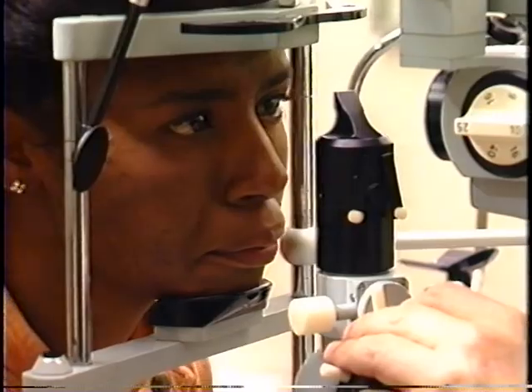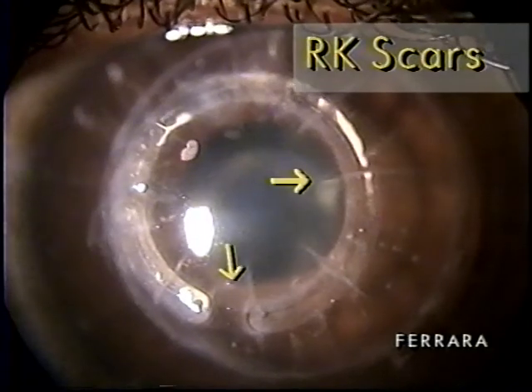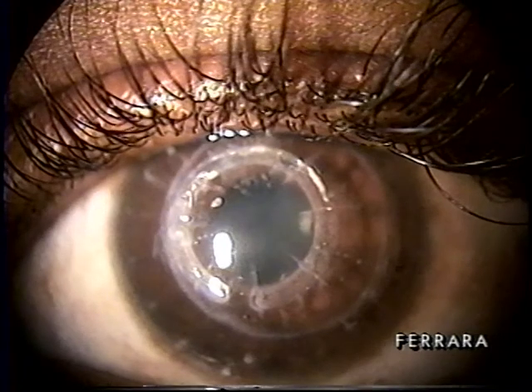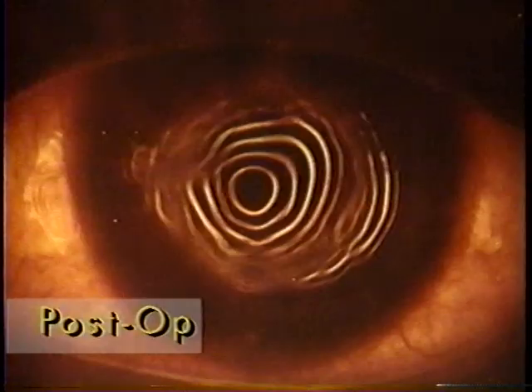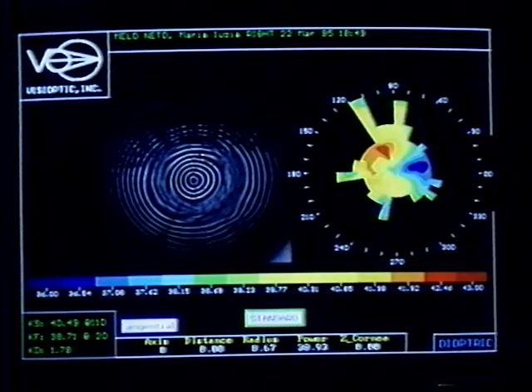This patient was referred to our clinic with prior history of corneal transplant, contact lens intolerance, and subsequent radial keratotomy in the donor cornea. The recommended conduct was a new penetrating keratoplasty, but we first tried implanting our intrastromal corneal ring in the graft. A three-month follow-up shows an asymptomatic cornea with good visual acuity. Sequential photokeratoscopy and corneal topography showed continuous improvement of corneal regularity. The effectiveness and safety of the superficial ring placement in the donor corneal stroma were impressive.